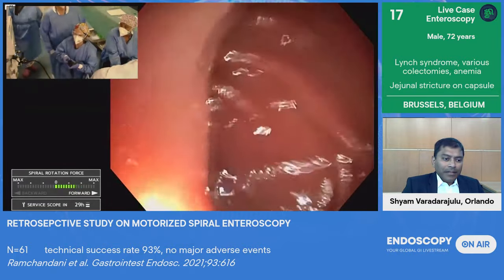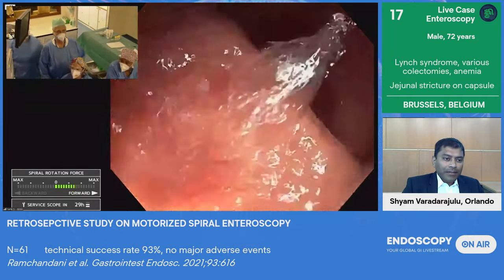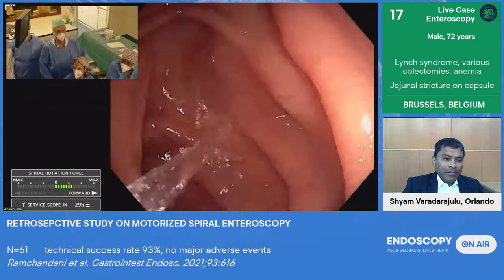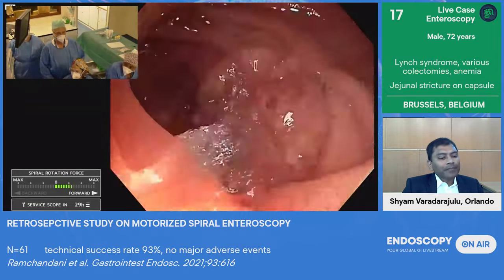So it's mostly, I think we have something here. So it's mostly putting water, aspirating, and straightening the scope while doing forward movements.